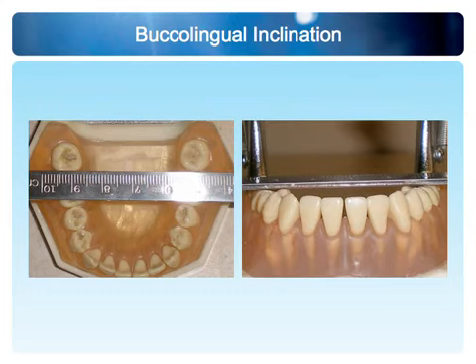Let me show you what this looks like in a picture. Again, you get to see my typodont. What I've done here with the lower arch of my typodont, I laid a ruler right across the first molars. And by laying a ruler across the first molars and then taking a look from the anterior view, you could appreciate that definition. It means that you would like to have all cusps touching the ruler.